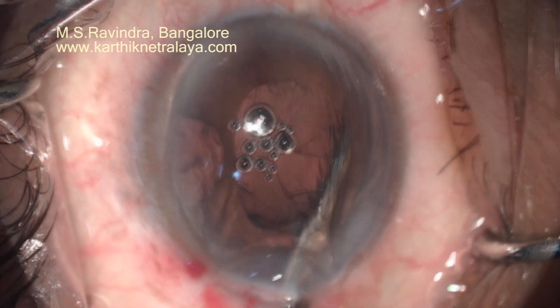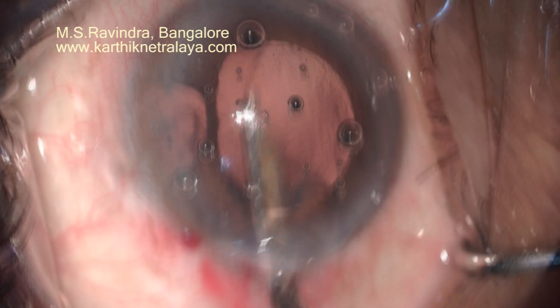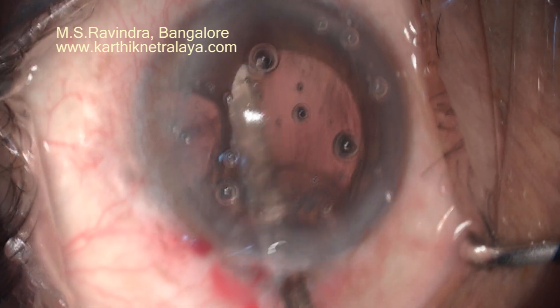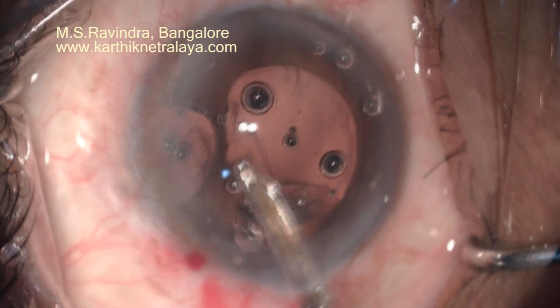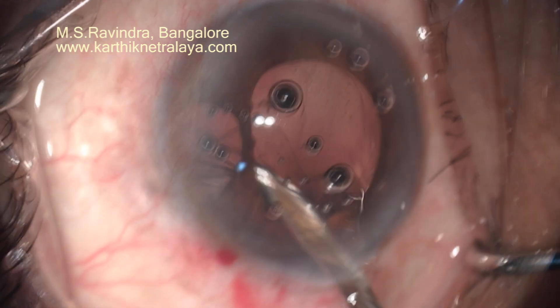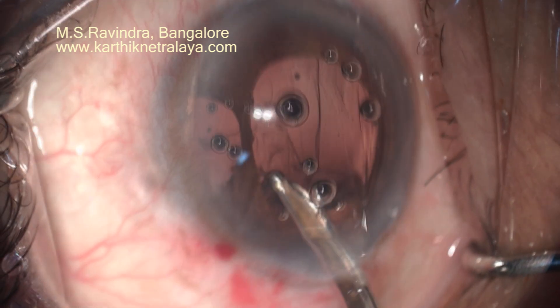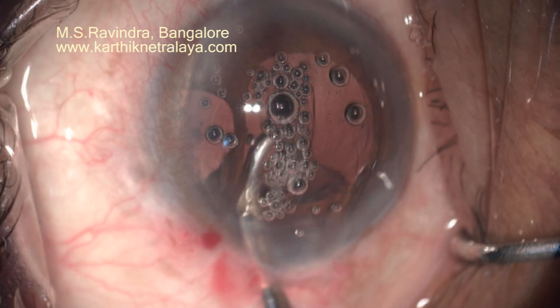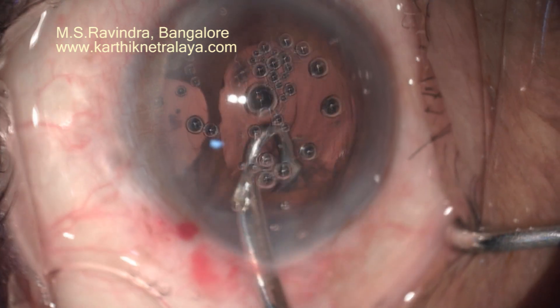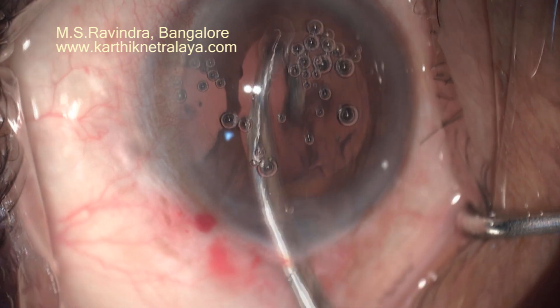Because there is no side port, I am using right-sided and left-sided J-shaped Simcoe cannulas to aspirate the cortex in the sub-incisional zone. The cortex aspirated can either be fully taken into the syringe or left in the middle of the anterior chamber so that as the fluid flows out, the cortex gets drained out of the anterior chamber.